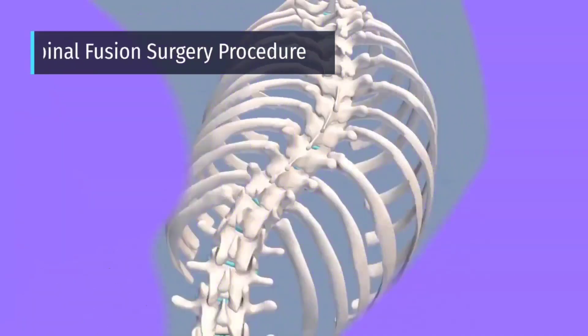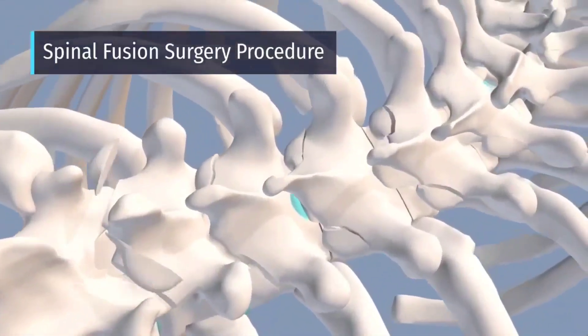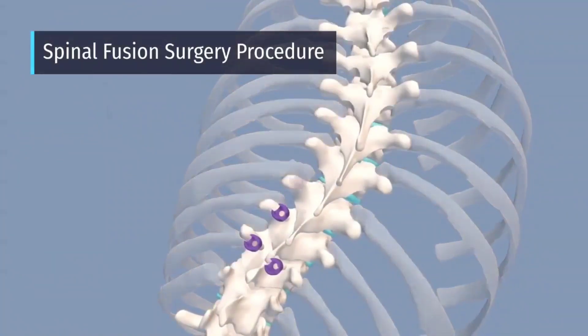An incision is made along the spine. Then the surgeons will remove the facet joints. Doing this will help the surgeons see where to place the screws better and allows the spine to be more flexible.